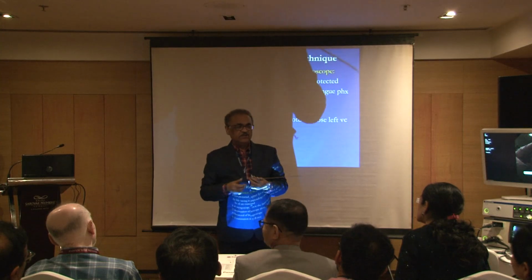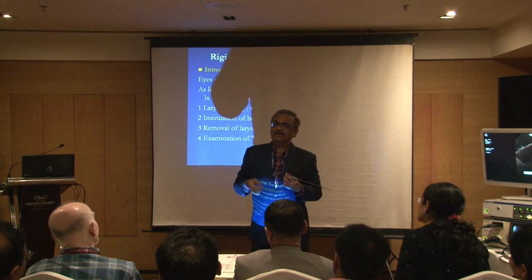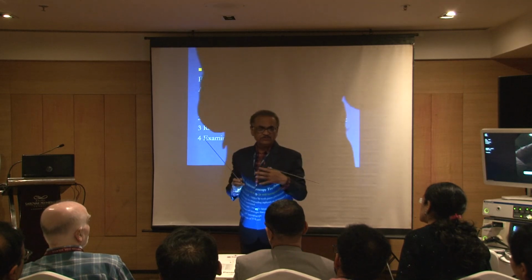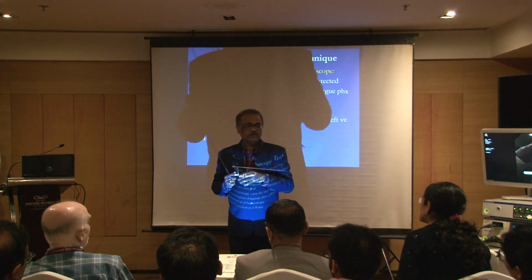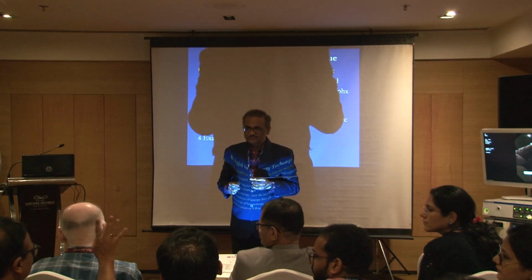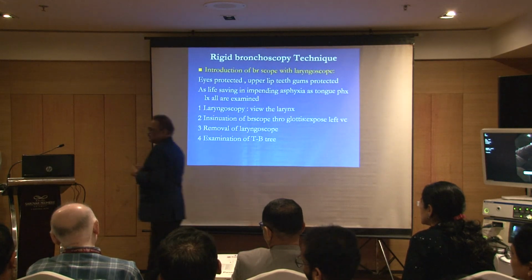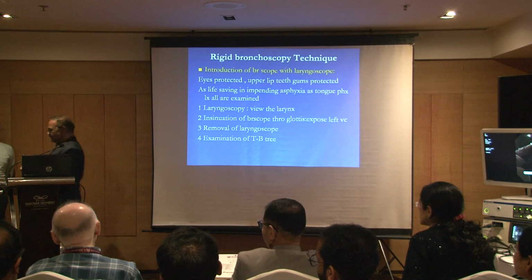Answer to his question is, nowadays I am using this forceps less and less. And the reason is the maneuverability of this is very difficult. And you cannot use these forceps below 1 year. The maximum incidence of foreign body is at 1, 2, 3 years, or to be specific, below 7 to 8 kg weight. Okay. So this is the instrument part which we don't have here to show you.